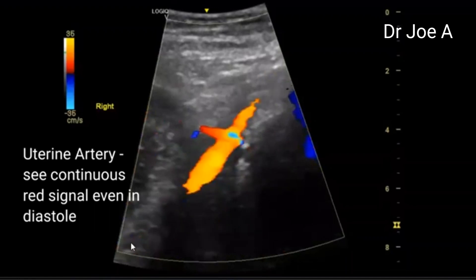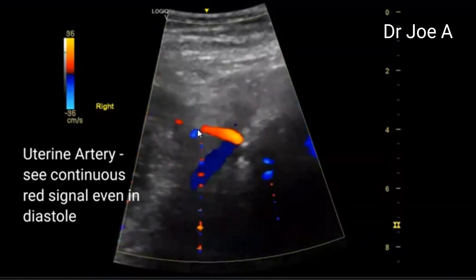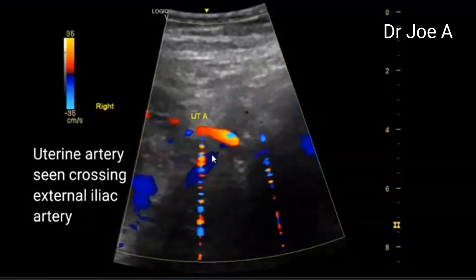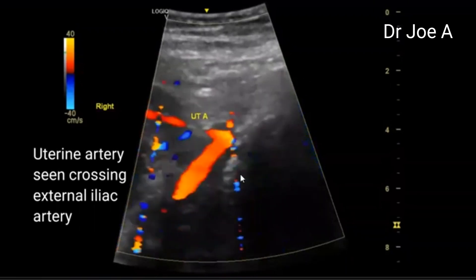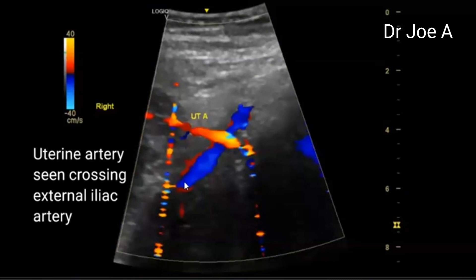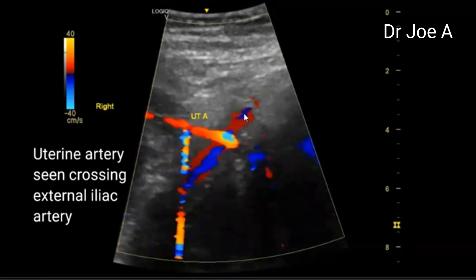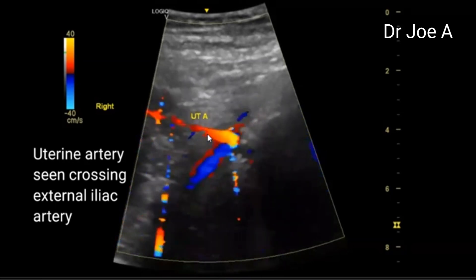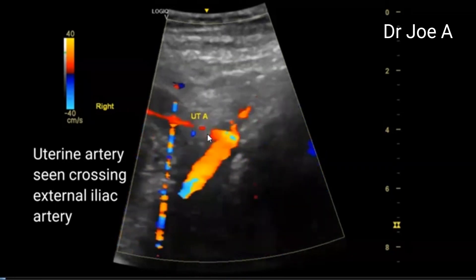In obstetric Doppler, one of the first things to see is the uterine artery. This is the right uterine artery, and that is the right external iliac artery. The right uterine artery passes over the right external iliac artery as it goes towards the uterus medially. The external iliac artery changes color from blue to red — blue signifies reverse flow during diastole, and red signifies forward flow. However, the uterine artery shows continuous red flow, meaning there is continuous flow even during diastole with no reverse flow. This is one of the hallmark signs identifying the uterine artery.